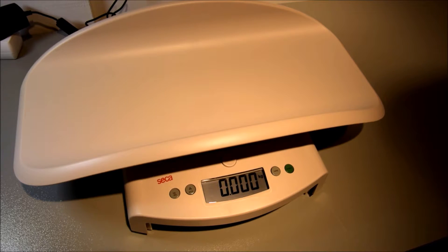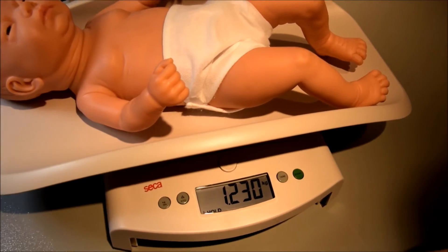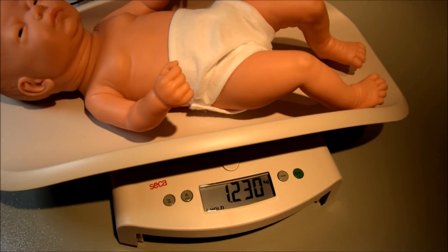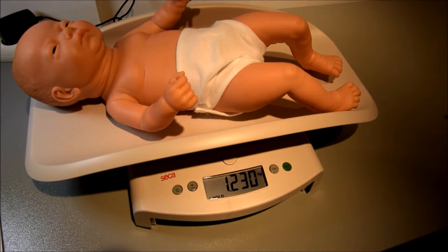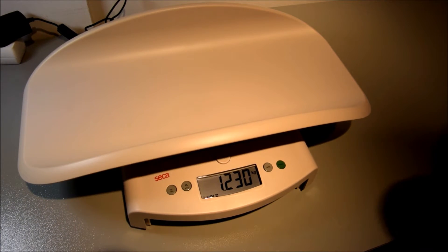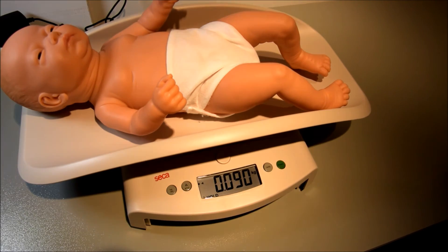The quantity of milk the baby has drunk during breastfeeding can be determined by using the breast milk intake function. To use the breast milk intake function, press the button store. After breastfeeding, measure the baby again and press the store button. The weight of the baby measured before feeding is deducted from the weight measured after feeding, so the quantity of milk intake of the baby can be seen.